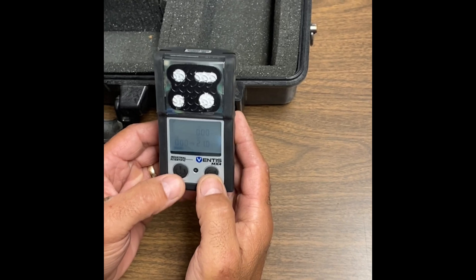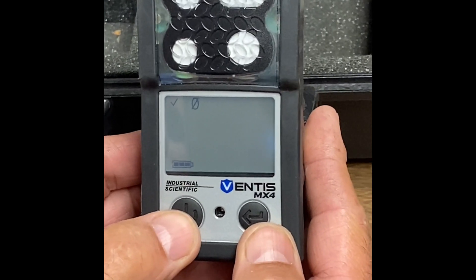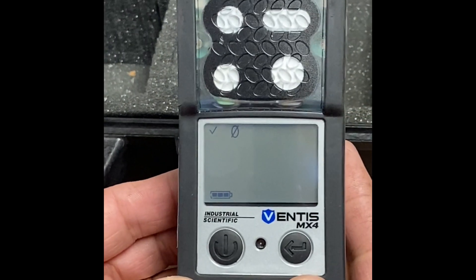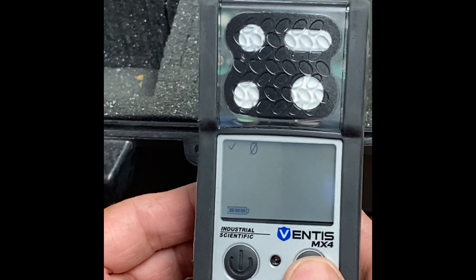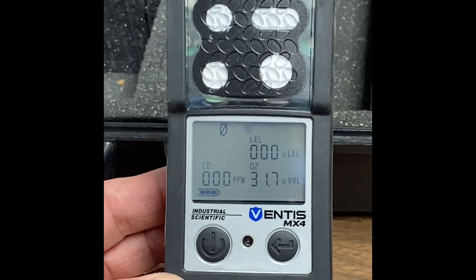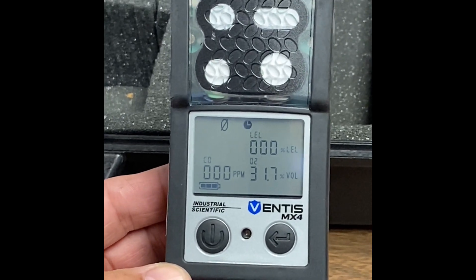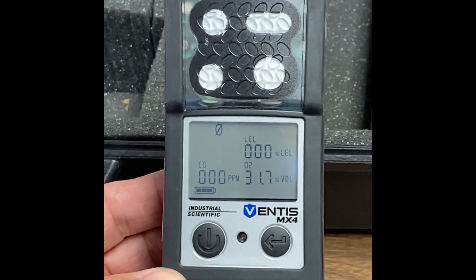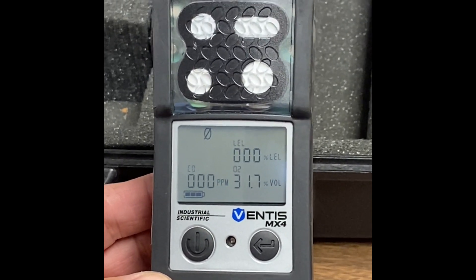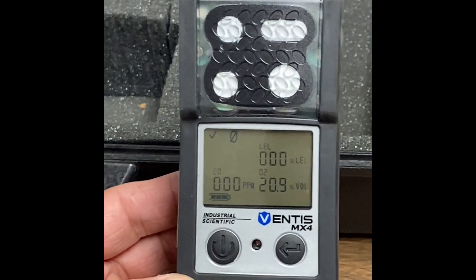We're going to hit the mode button a total of two times until you see this zero here. We're going to zero the monitor. Hit the enter button when you see that zero. You're going to see a clock, and you want to make sure you're in an area that is not contaminated. That clock will go for a few seconds, and then it should give you an indication when it's complete by a little check mark in that upper left-hand corner. The check mark indicates that it's been fresh air calibrated.